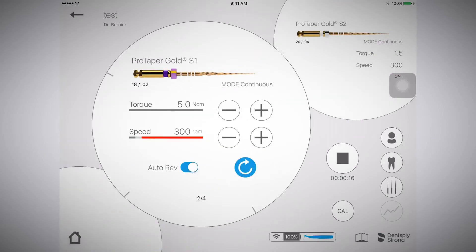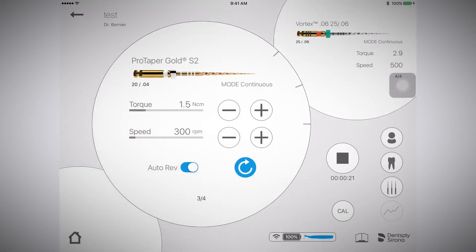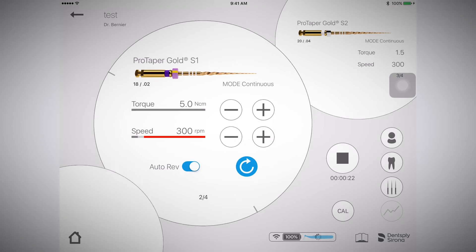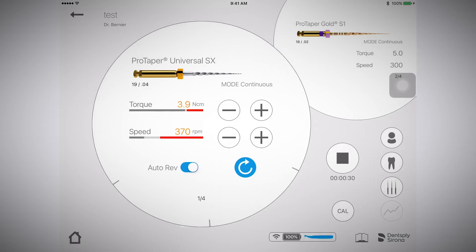The speed and torque settings are preprogrammed for each file. You can adjust these on the fly during a procedure. Adjustments will not affect your settings within your systems or sequences.